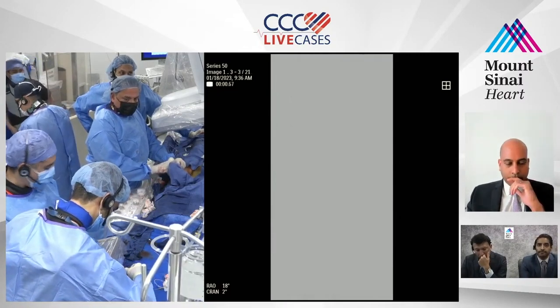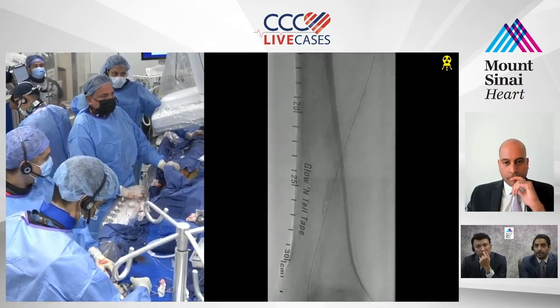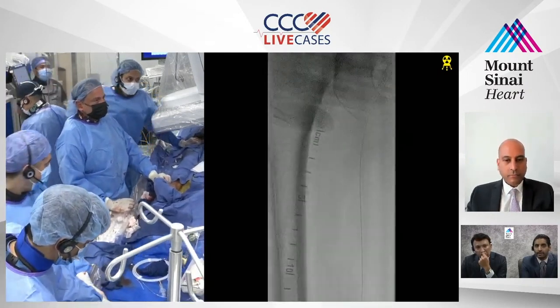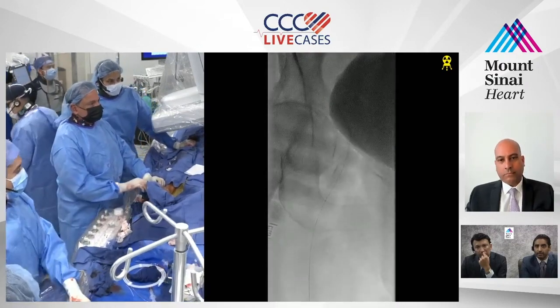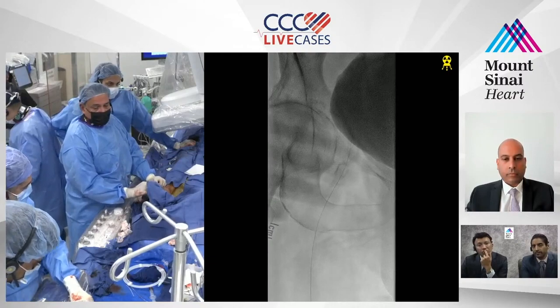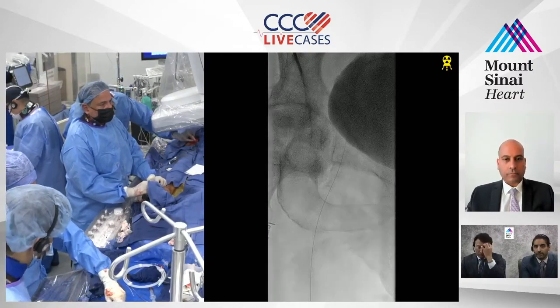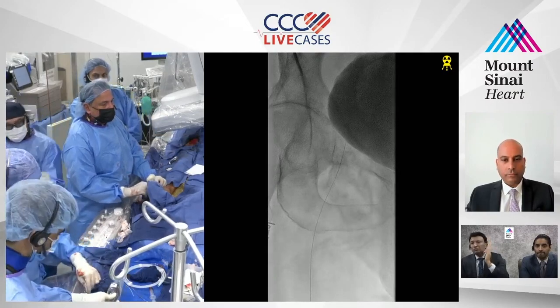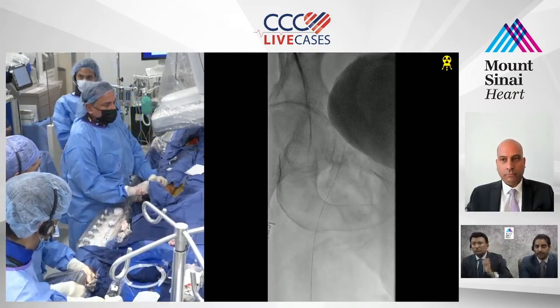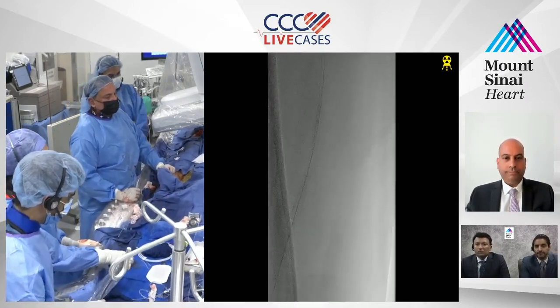And I think DCB would too. I think that would be the best option. I think we can all agree. IVL for the calcium and DCB without scaffolding would be ideal for her. And we're not going for perfection here. We just want this vessel to be a little bit more open than it currently is. And especially having a stent here would add an extra layer of complexity if she ever needed surgery. Exactly.